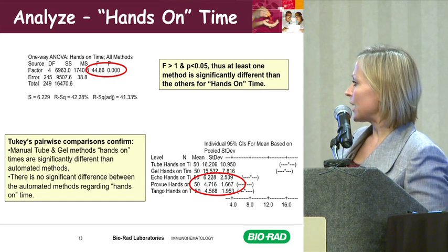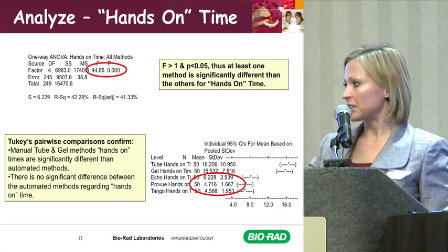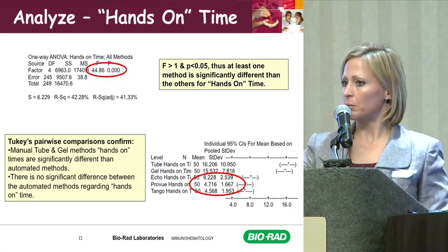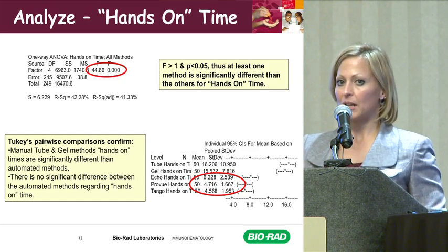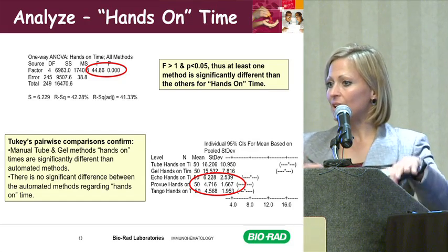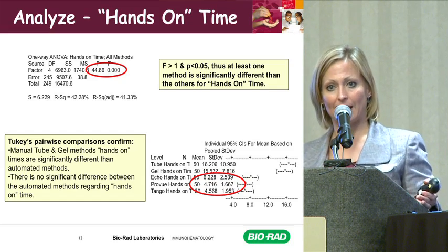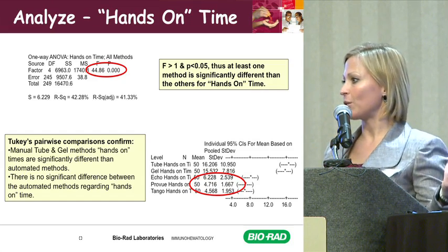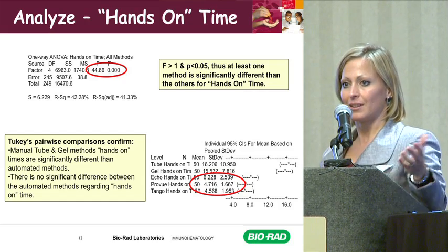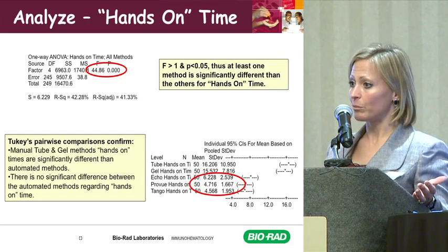And then the Tango, this facility, this was my last assignment, those specimens came in, on the instrument. Ten minutes later, four of them came in, put them on the instrument. Two came in, put them on. I mean, it was just non-stop. So to see them manage the samples and how they did it, I can compare the hands-on time. It didn't look different, but having a workload like that versus the other two, where you got one or two specimens and you're waiting for the second one to come in so you can put it on the instrument and have a run, I mean, you can't compare them, really.